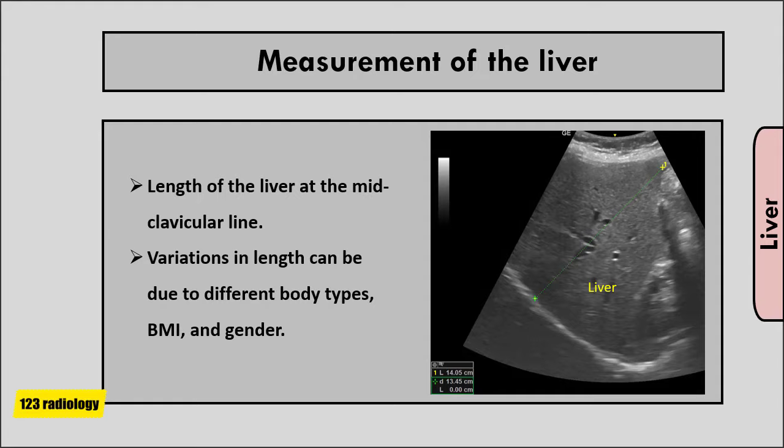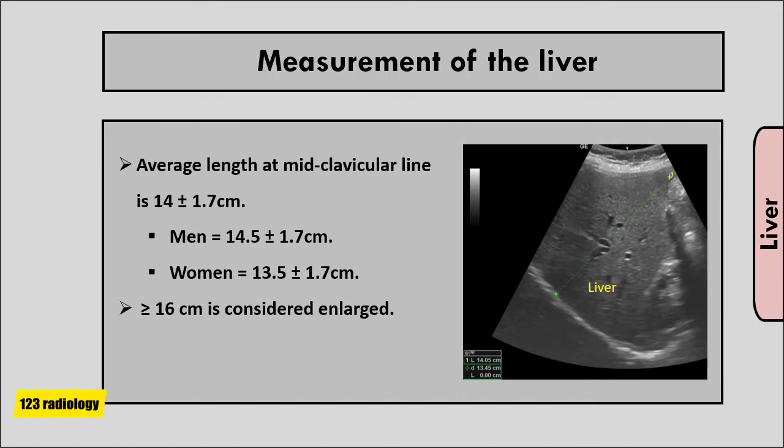The length of the liver at the mid-clavicular line is the most commonly used measurement for evaluating liver size. Various studies have found a range of normal length, with variations due to different body types, body mass index, and gender. The average length at mid-clavicular line is 14 ± 1.7 cm, with a mean length for men of 14.5 ± 1.7 cm. A measurement of 16 cm or more is considered enlarged.